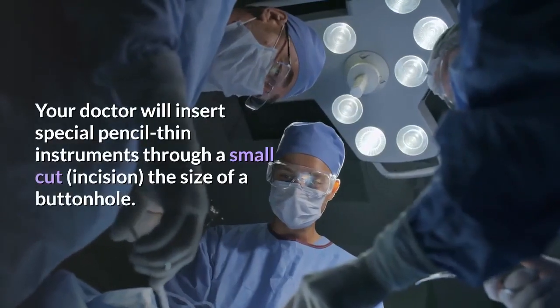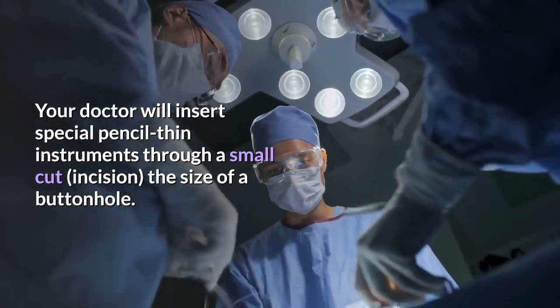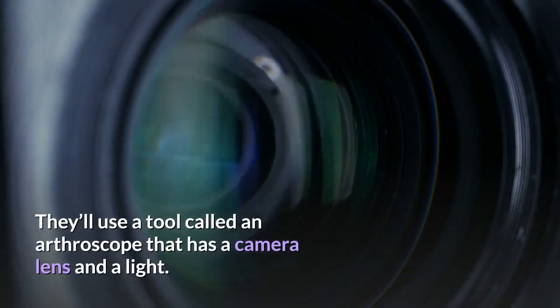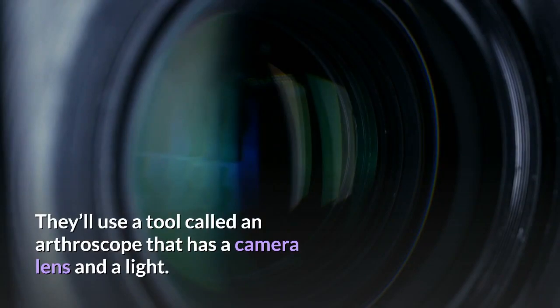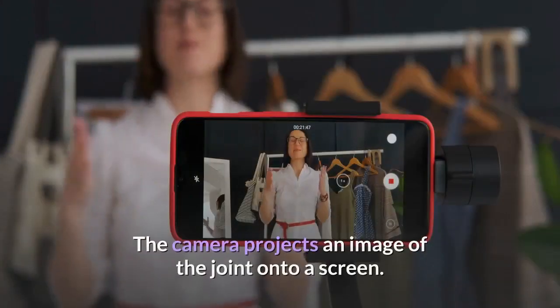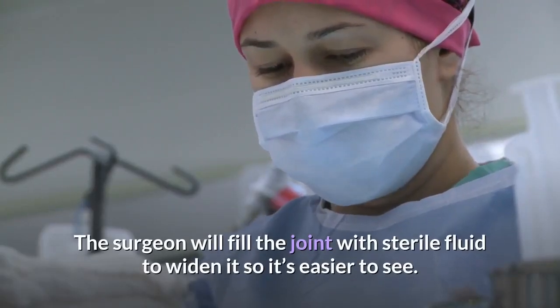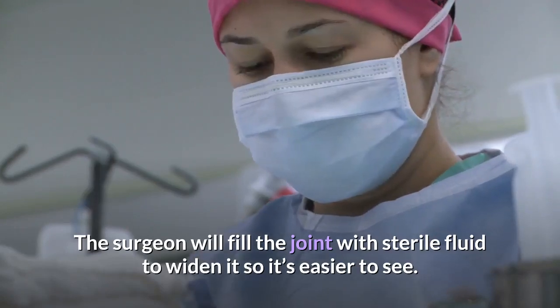Your doctor will insert special pencil-thin instruments through a small cut, or incision, the size of a buttonhole. They'll use a tool called an arthroscope that has a camera lens and a light, allowing them to see inside the joint. The camera projects an image of the joint onto a screen. The surgeon will fill the joint with sterile fluid to widen it so it's easier to see.